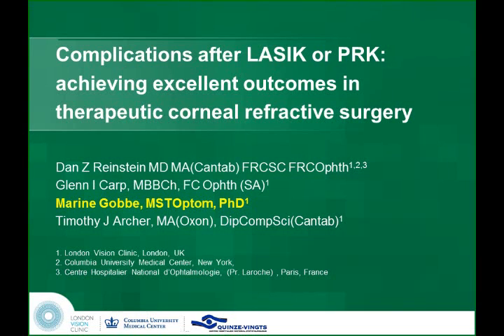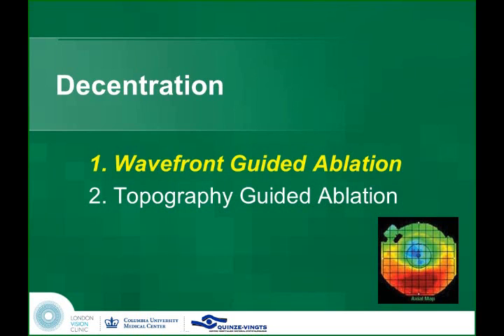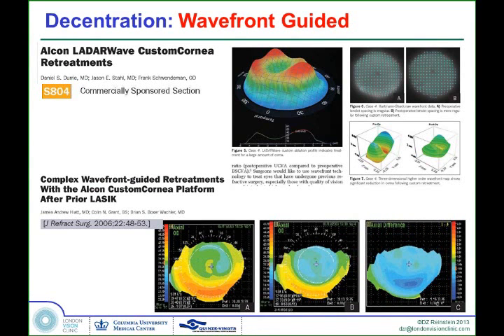So I'm going to talk about how best to treat decentration. We can do wavefront-guided ablation, which may be appropriate in some cases, or we can do topography-guided ablation. I'll go over the wavefront-guided ablation first. These are two case reports of successful treatment of decentration with wavefront-guided. You can see here the difference between the pre-op aberration and the post-op.